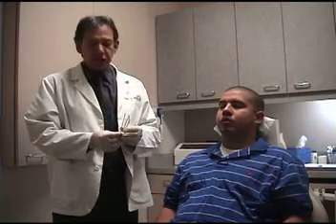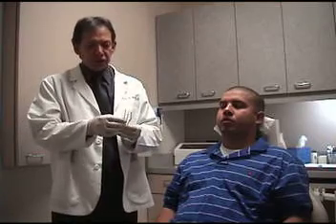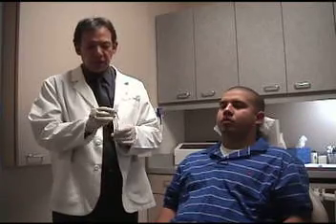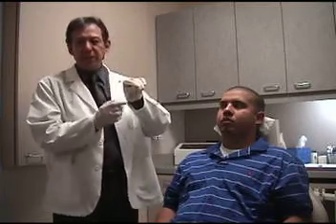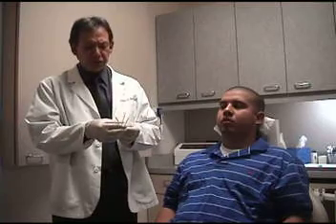We will use various separating mediums and positioning tools here to hold the mandible's cant in three-dimensional corrections. So you'll see that one is a round cotton tip applicator. We have a three-way syringe tip, and we also have one of these micro brush tips. They just have different diameters, okay, but they're all round. And they need to be round so that we can capture these three-dimensional corrections.